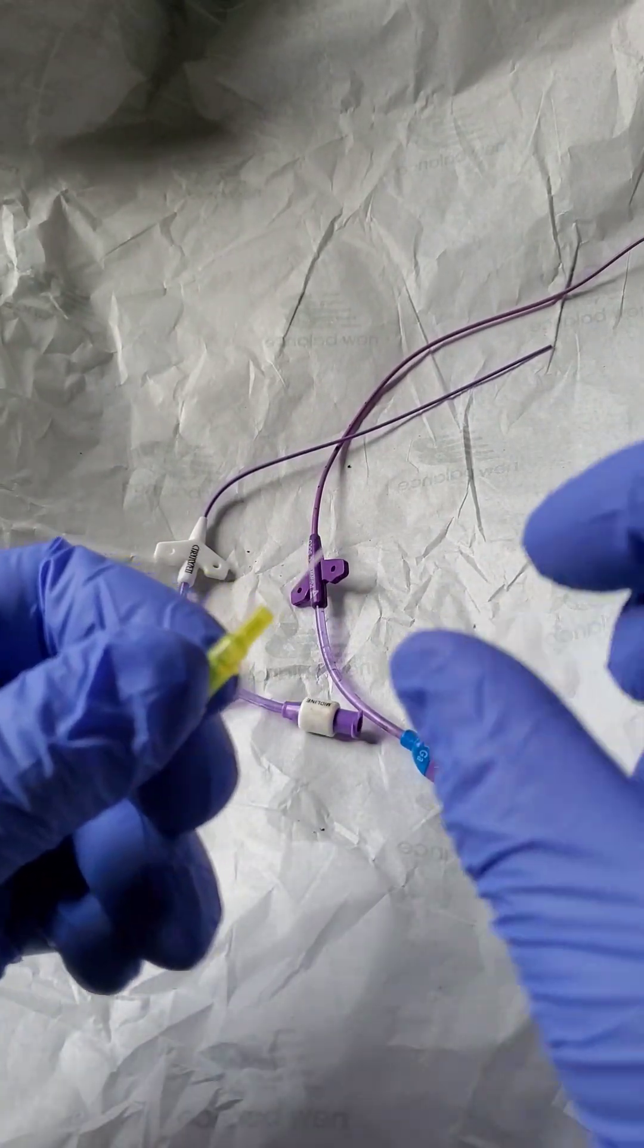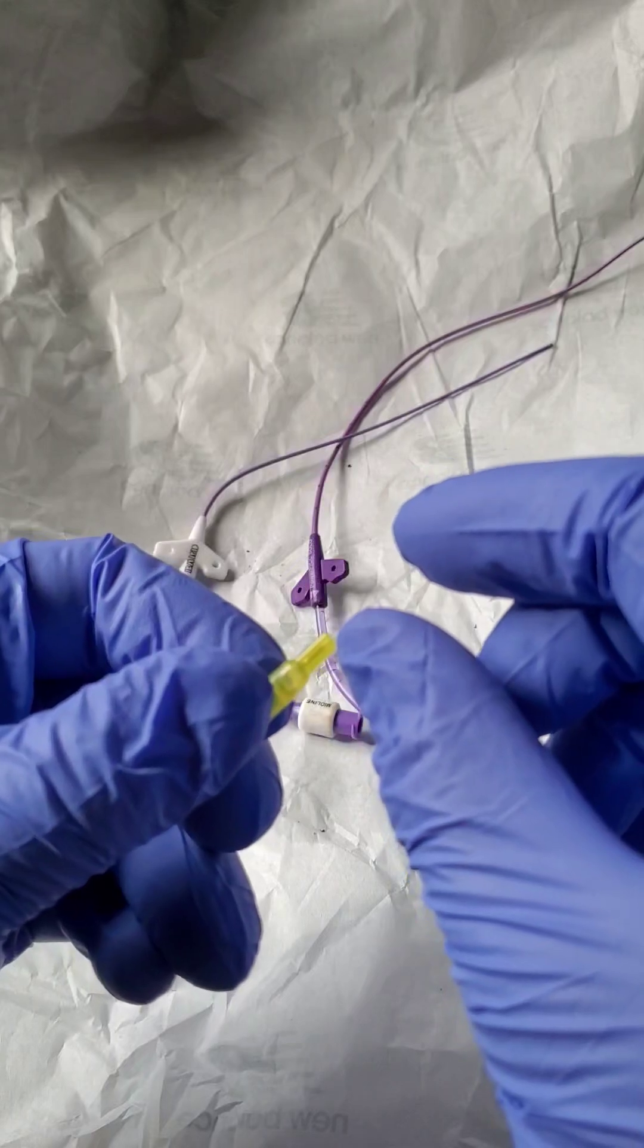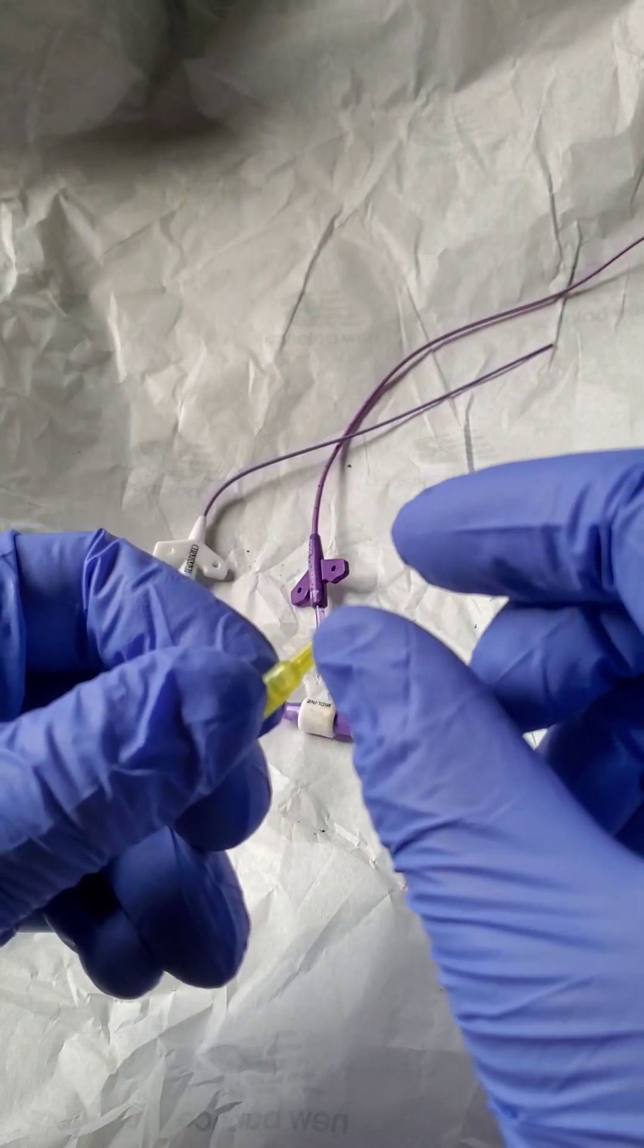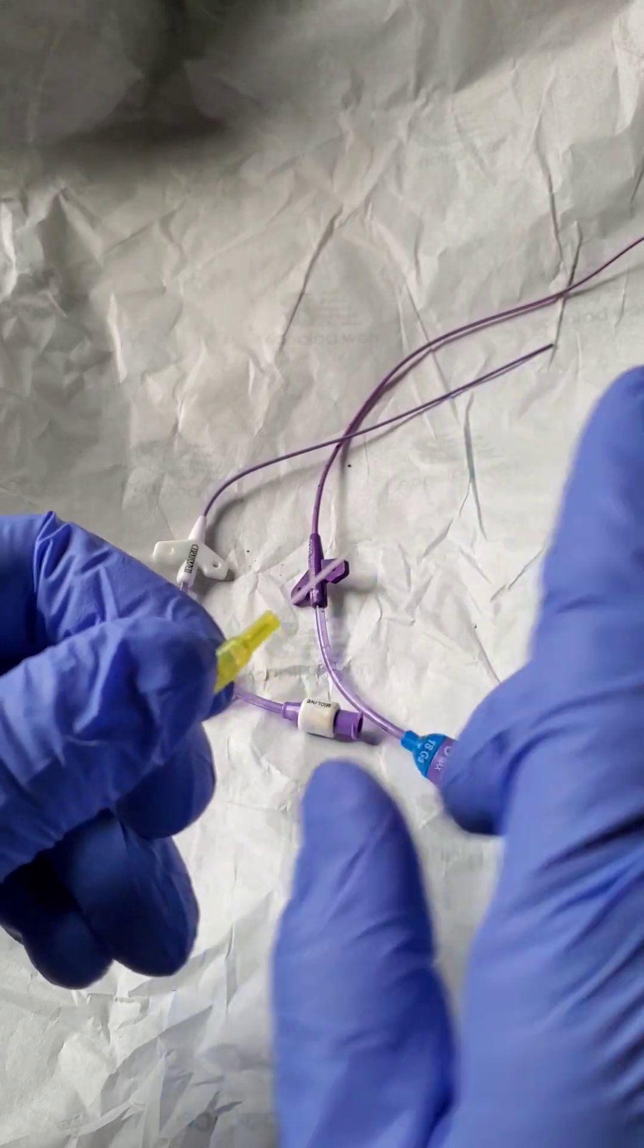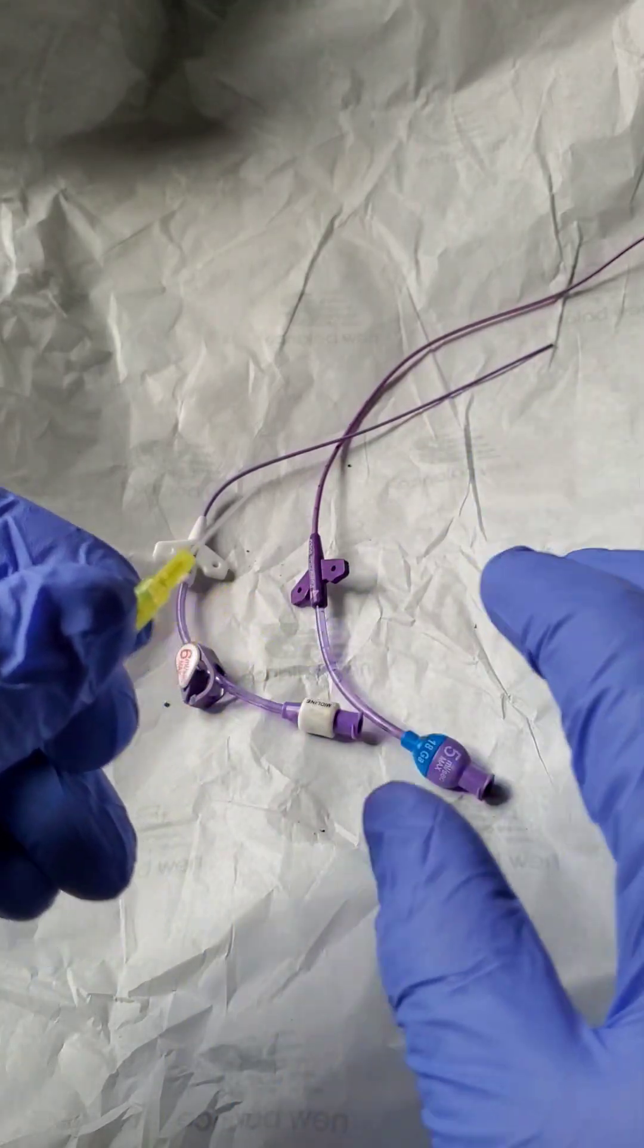The IV catheter, you are probably familiar with this, is relatively short, about half an inch to three quarters of an inch. It simply provides access to the vein so that we can introduce medication or saline.